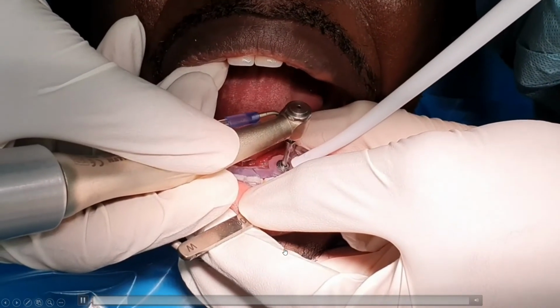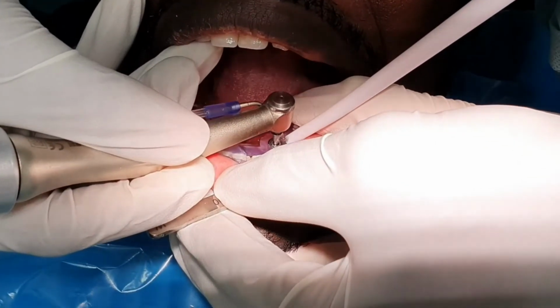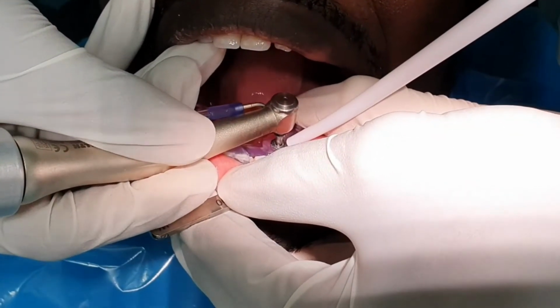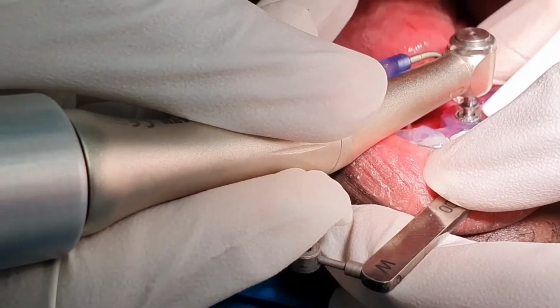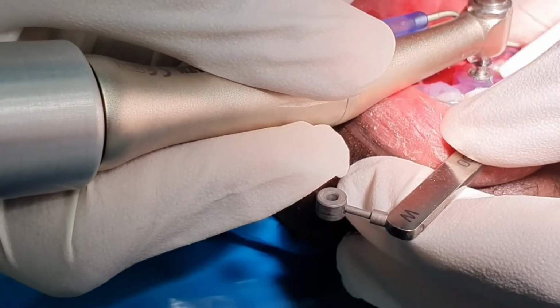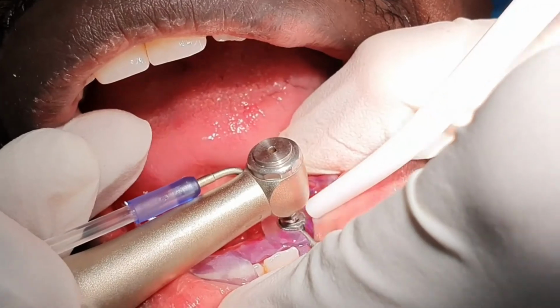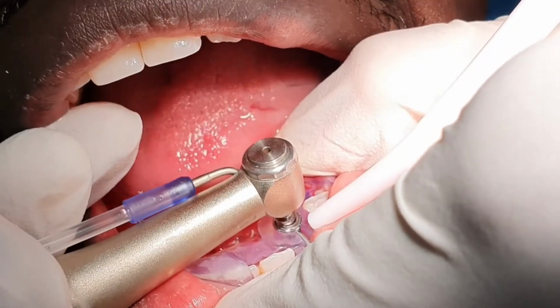And you can see the irrigation switching in now, and the irrigation runs down the flutes of the burr. And you remember that when we planned this case we were expecting dense bone near the apex, and you can see the surgeon is having to press quite heavily in this area to really make sure that burr goes the whole length.